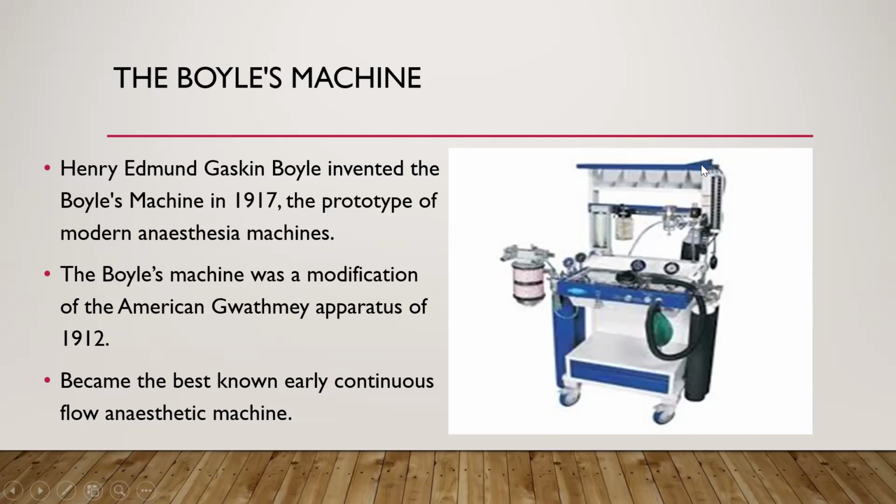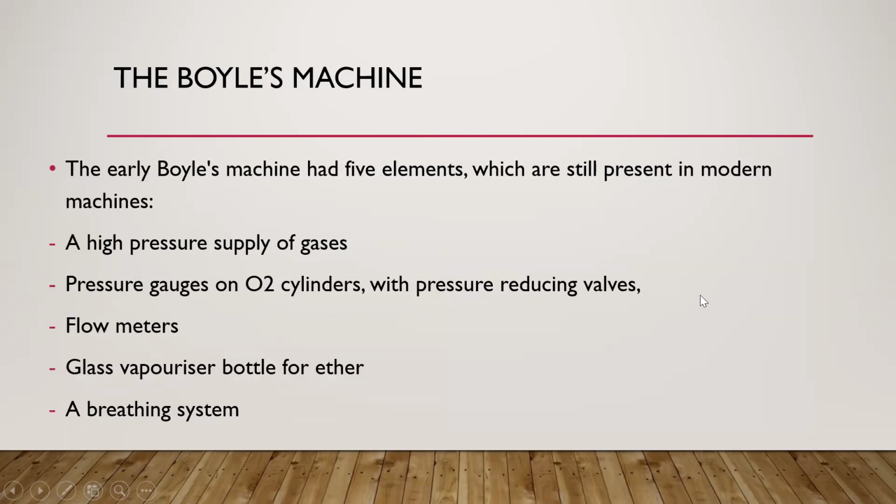And in those days, the question they used to ask us was: what are the characteristics of the tires on the anesthetic machine? What should the tires be made of? Anti-static property. Yes, we are not smoking today. I like that. So this is the basic anesthesia machine.